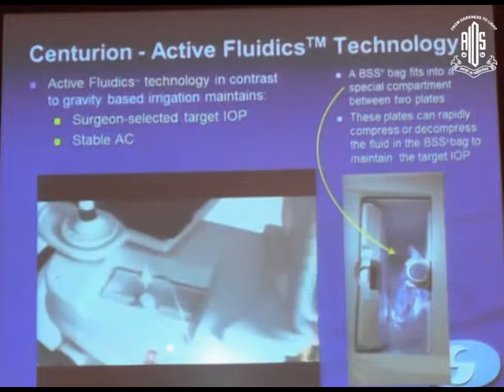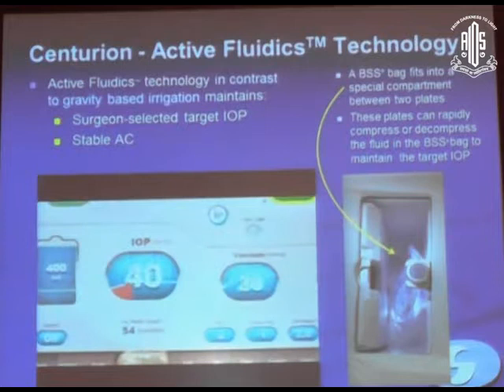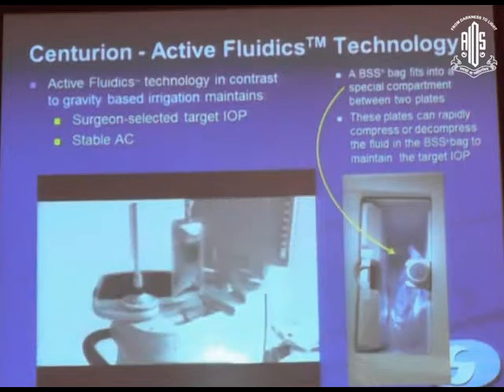You are not putting the IV bag on a pole. It's going into the machine. The bag fits into the special compartment, as I showed you, between these two plates. The plates can then compress or decompress the fluid bag, and that is how the chamber is maintained, and the entire IOP is maintained. So in this active fluidics, you can have a surgeon-selected IOP, which I showed you, and a very, very stable chamber.